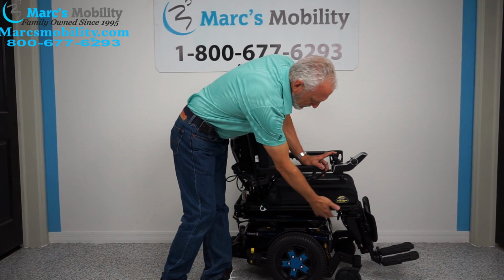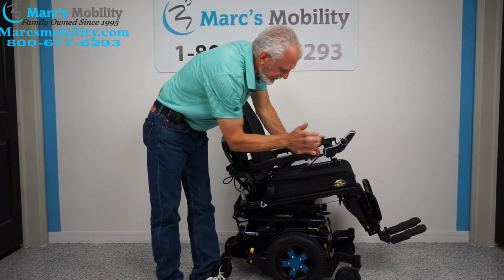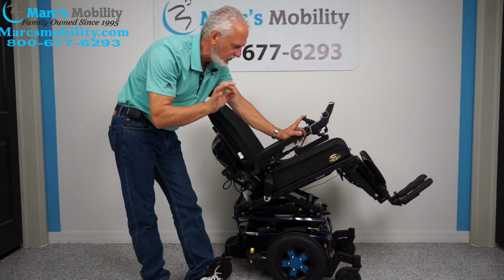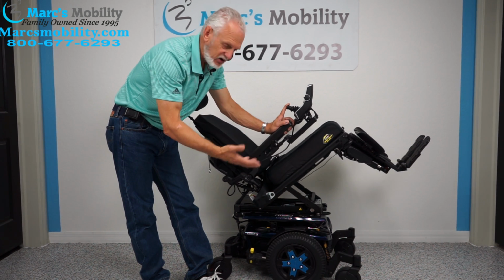The electric tilt is when the base right here goes back. So when the base goes back, of course, the legs and the back are all connected, so they're all going to go with the seat. This is called electric tilt. This is a good usage if you want to sleep or you want circulation.